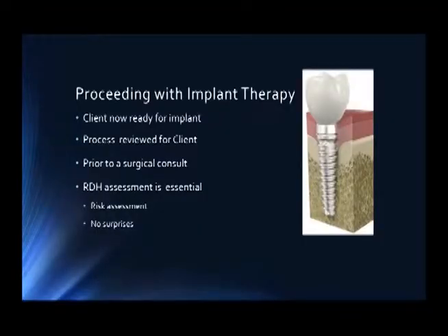So now, as we're proceeding to implant therapy, our client is now ready, and we review the process with our client ahead of time so that they know step by step what to expect, and let them know, okay, the next step is going to be a surgical consult.